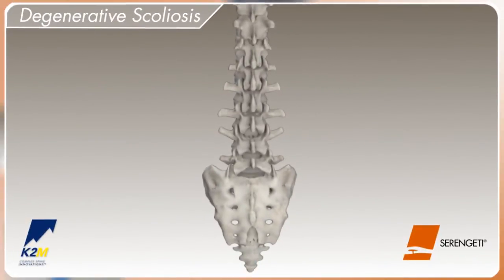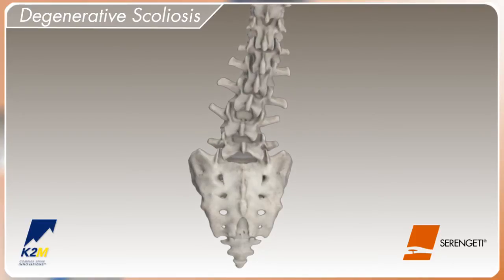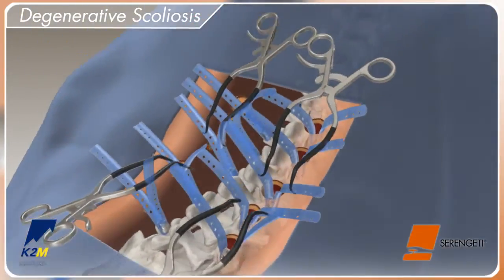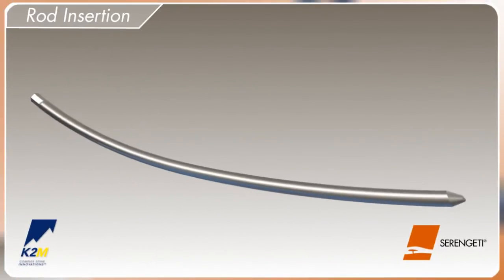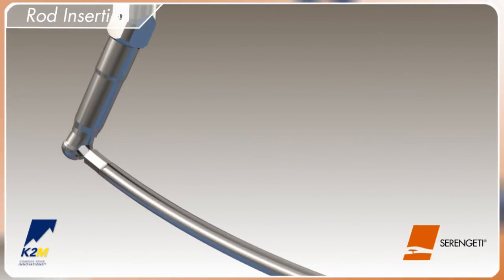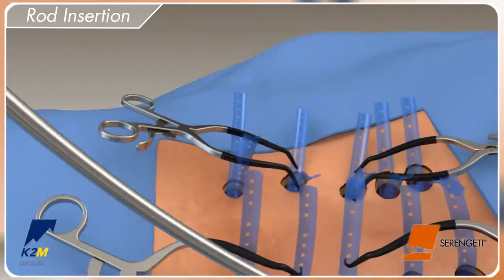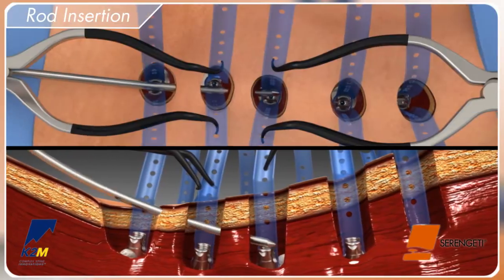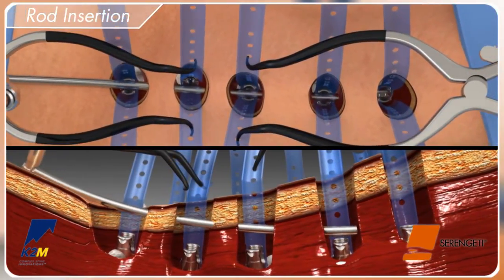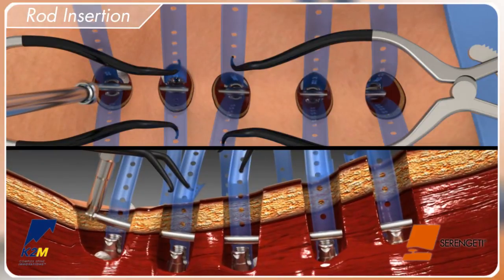Even in more complex cases, the benefits of minimally invasive surgery are becoming more and more apparent. Place pedicle screws percutaneously through the standard approach. An appropriately sized rod may be attached to the MI rod inserter and contoured using a French bender. The rod can be inserted into the complex curve utilizing the flexibility of the Serengeti retractors, which allow for direct visualization while passing the rod from screw head to screw head — a luxury unique to the Serengeti system.